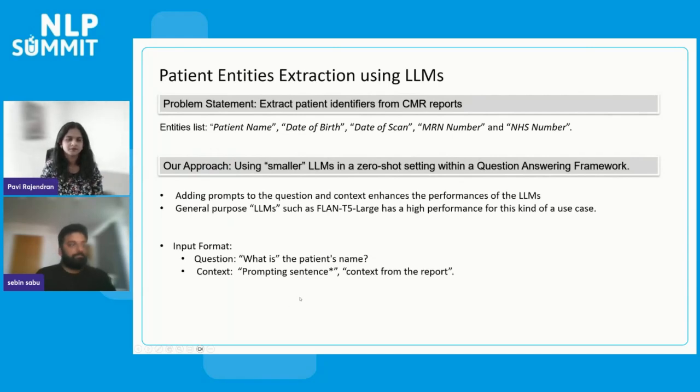So this gives an outline of the challenge we were facing in extracting information from the CMR reports. For an outline, it contains almost 10 years of data. So necessarily they were not following a very strong format over time.